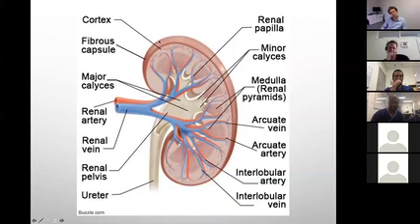All right, anyway, so that's one thing. So you got a fibrous capsule, which is going to be quite echogenic because of its reflectivity. And you got some hypoechoic cortex below that capsule. And you got more hypoechoic, almost like anechoic pyramids that run in between below that. So this section from the capsule up to these triangular, pyramid-shaped pyramids, this tissue is the cortex. And where the pyramids are all running down here, that's your medulla.